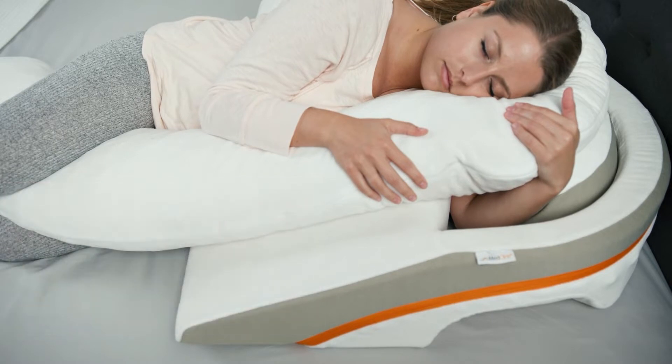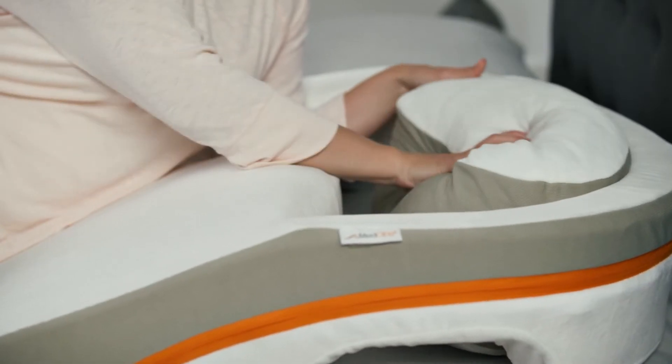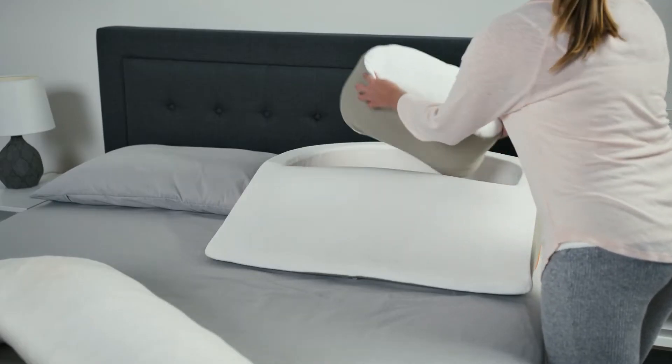In the second position, your elbow and your arm provide a much better anchor to prevent you from sliding down at night. Keep in mind that you can move the smaller insert pillow around in the arm pocket so it provides support for your shoulder, or you can move it out of the way entirely.